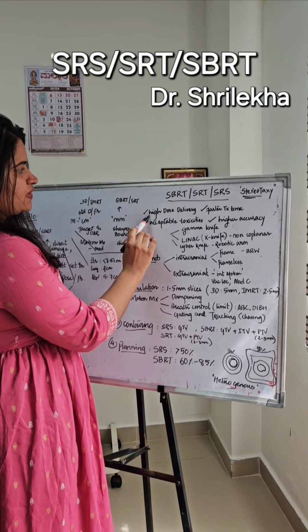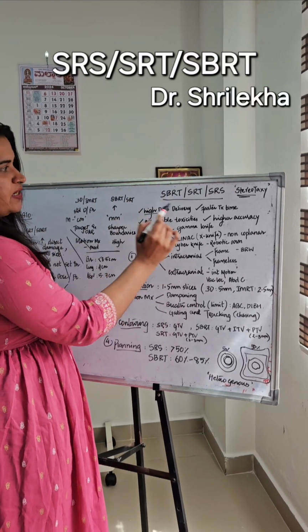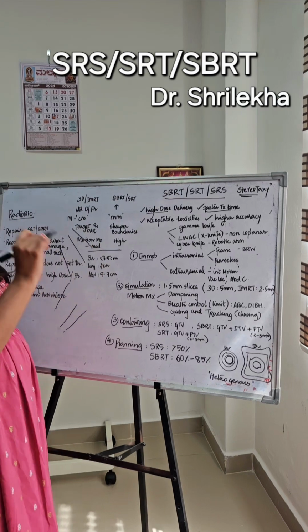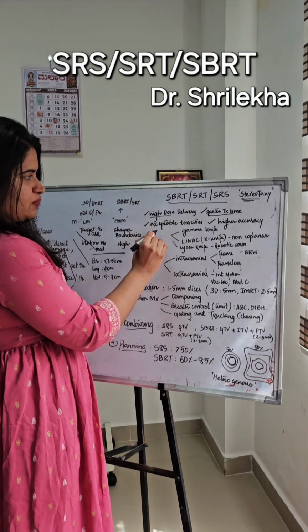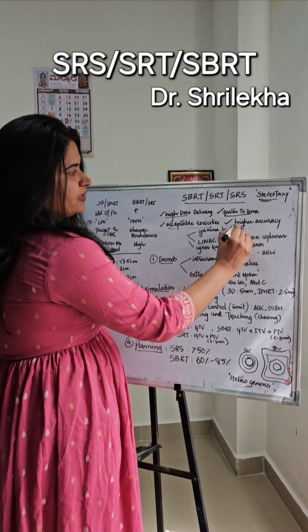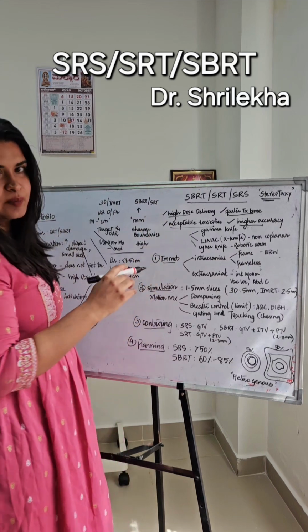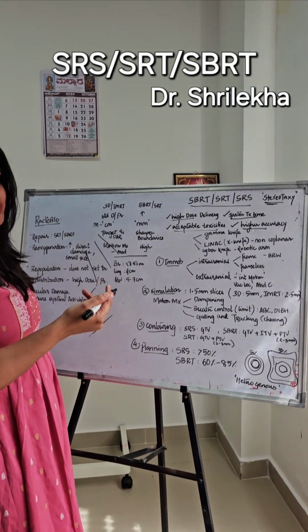The features of this are high dose delivery. There is a very high dose given per fraction, which leads to faster treatment time with a decreased number of fractions, and both of these are possible with acceptable toxicity to the normal structures, and there is high accuracy. So through all this there is much better patient comfort and good outcome for the patient.